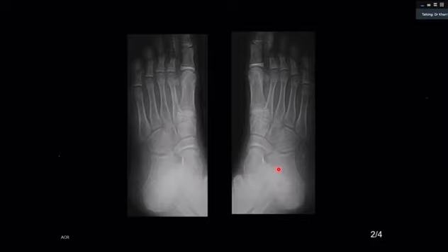But you will not find a bony bar. MR is considered very sensitive there. In many cases CT might be a savior. Having said that, usually in an FRCR exam, they go for plain films.